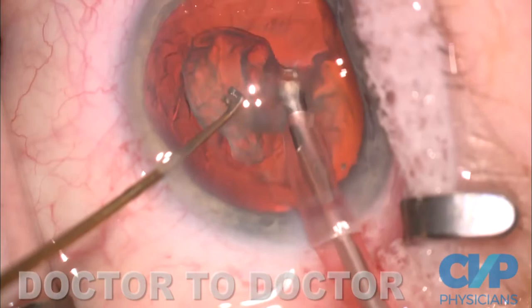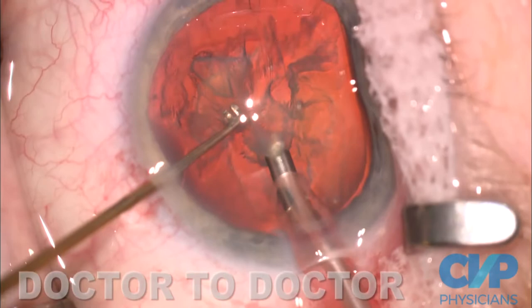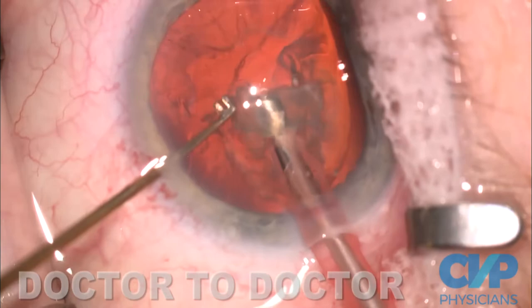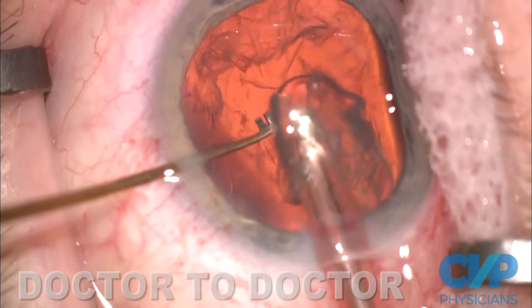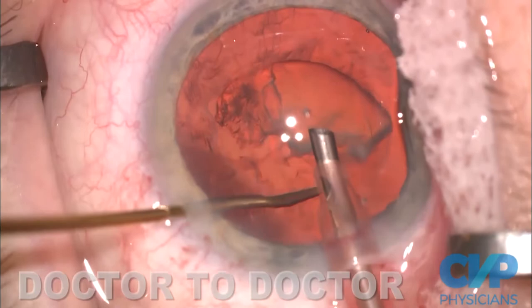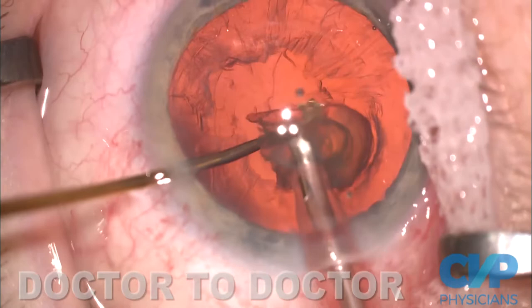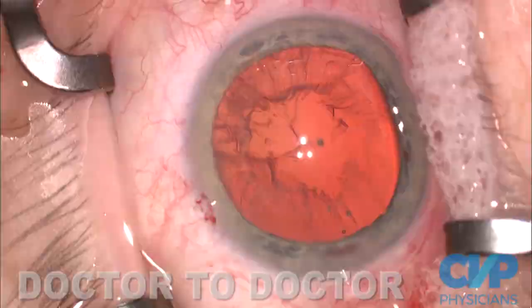I go into the lower half of the lens and embed. I give a short burst of phaco to impale the lens, making it easy to crack the hemisphere into quadrants. Again, tipping the apex up, working adjacent to the next quadrant in the deepest part of the chamber, and taking my time. I watch the posterior capsule — if I see any trampolining, I'll raise the bottle. For the last piece, there's no other quadrant to protect the capsule, so I put the second instrument behind the last bit. That way if I did get a sudden trampolining effect, I won't impale the capsule accidentally. The nucleus is gone; the chamber's been deep the whole time, and the cornea never knew we were working because the chamber was full of Helon 5.